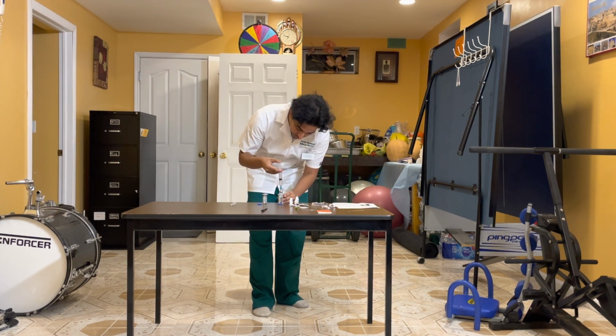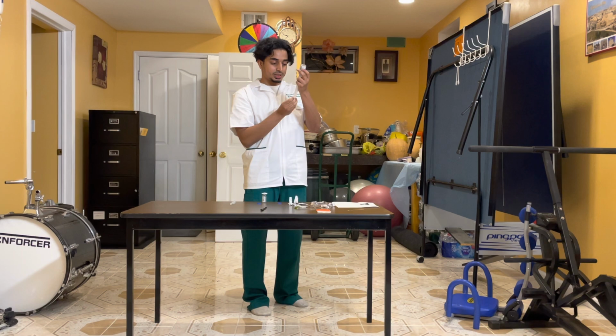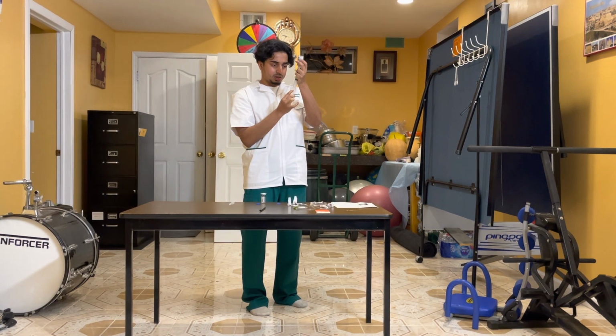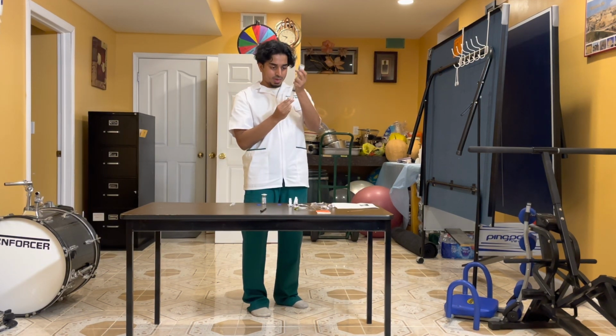I insert it first with the air, and now I can take out the 5.6 milliliters. I'll make sure that there's no air bubbles. Perfect.